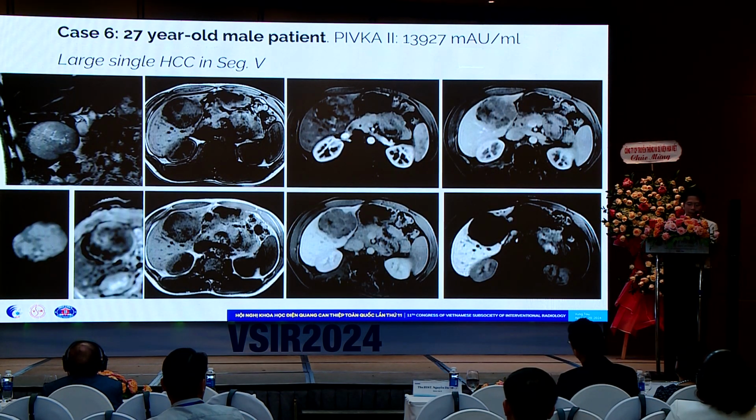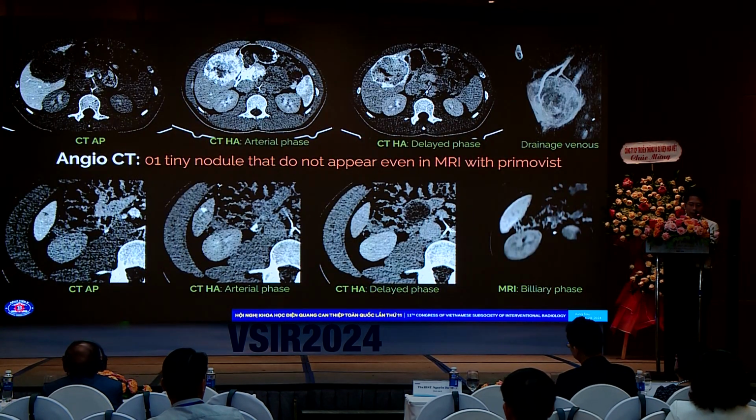Another case, a young male patient with a large HCC in segment 5. The patient did not consent to surgery, so we performed TACE. In angiography, we can see the large tumor has the typical features of HCC.